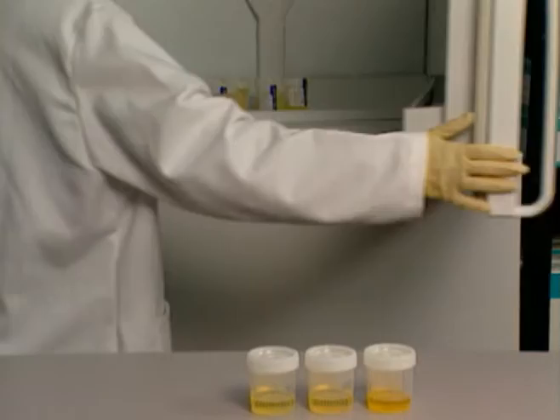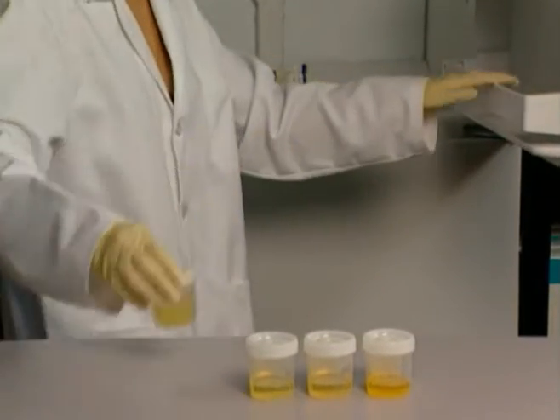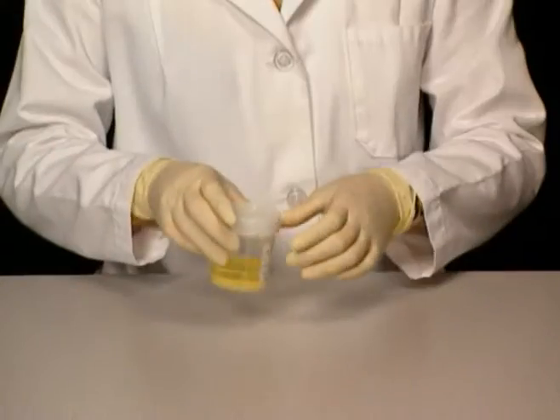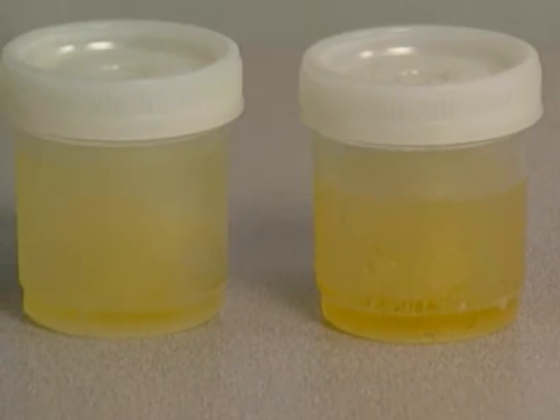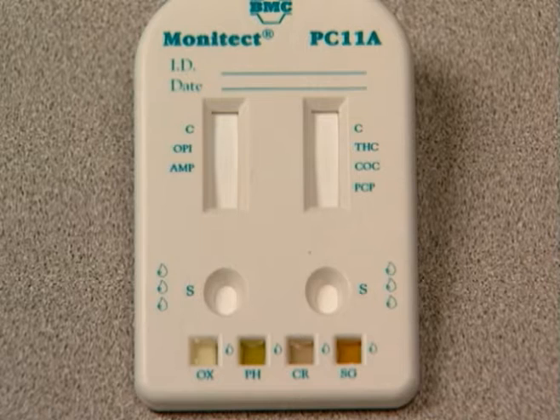Specimens that have been refrigerated must be brought to room temperature prior to testing. Previously frozen specimens must be thawed, brought to room temperature, and mixed prior to use. Frozen samples are not recommended for use with adulteration testing. The simple test procedure for Monitect drug screen cassette with adulterant tests involves the following.